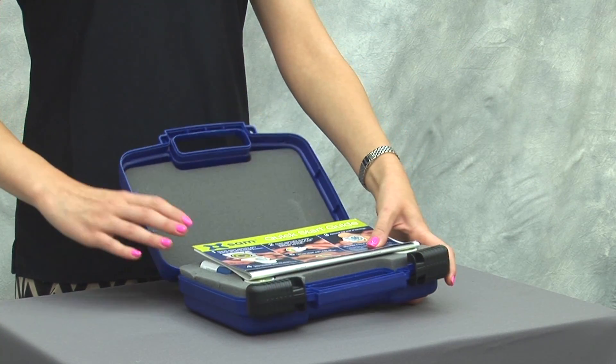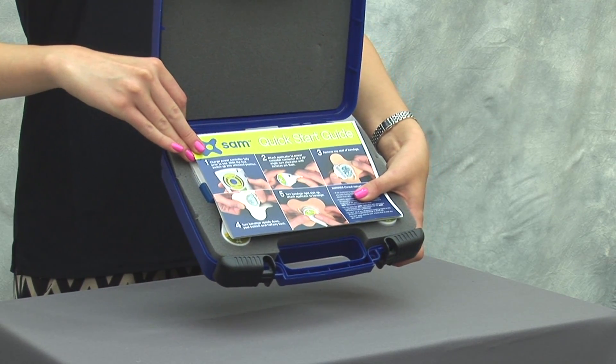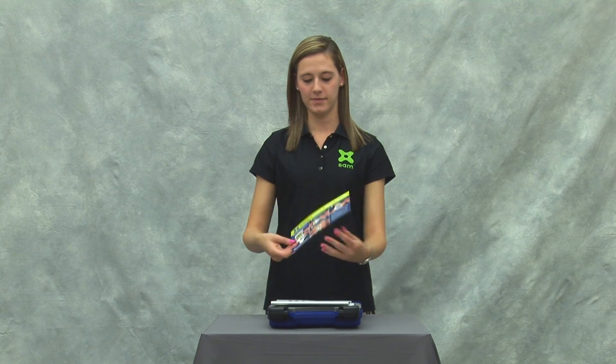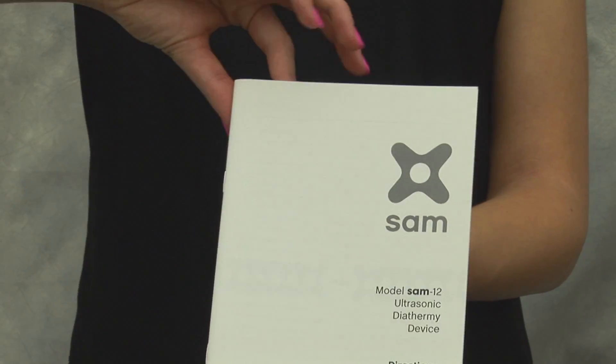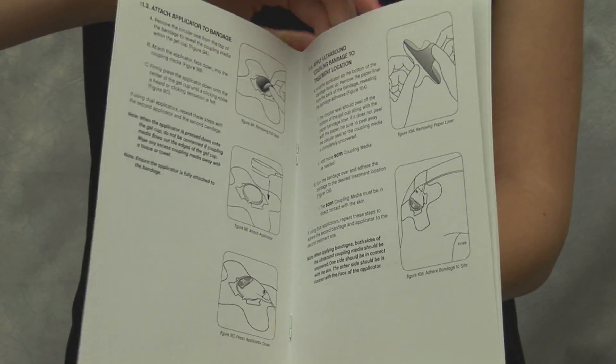Inside, there's a quick start guide with basic instructions on how to use the device. A user manual including detailed instructions of use, as well as troubleshooting and safety information.